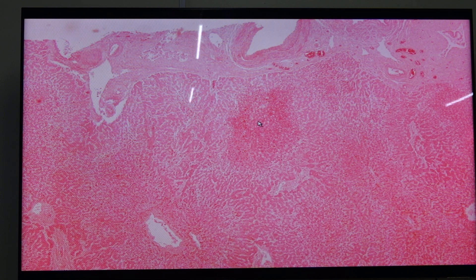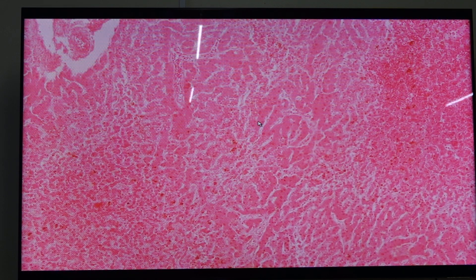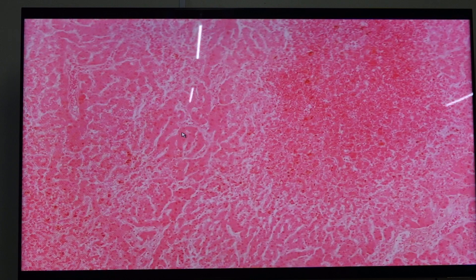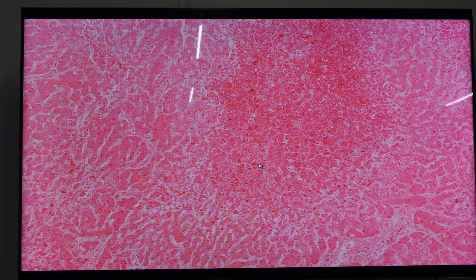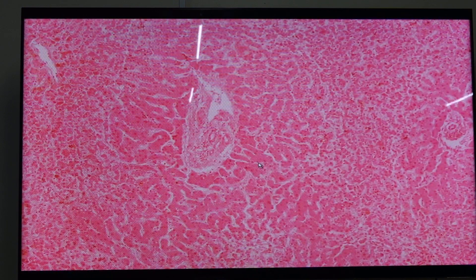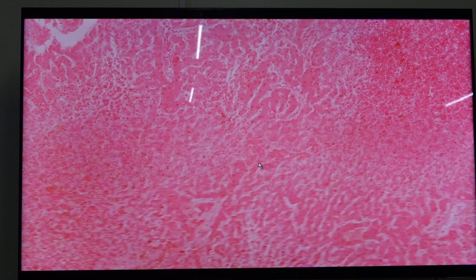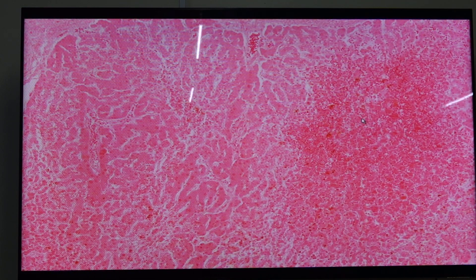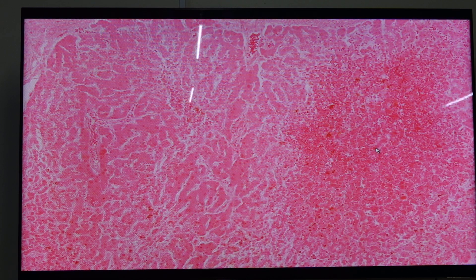The darker areas signify the presence of necrosis and hemorrhage. At high power magnification, you have viable hepatocytes and areas of dead hepatocytes as well as hemorrhage. Later, when those areas undergo fibrosis, we call them cardiac sclerosis.